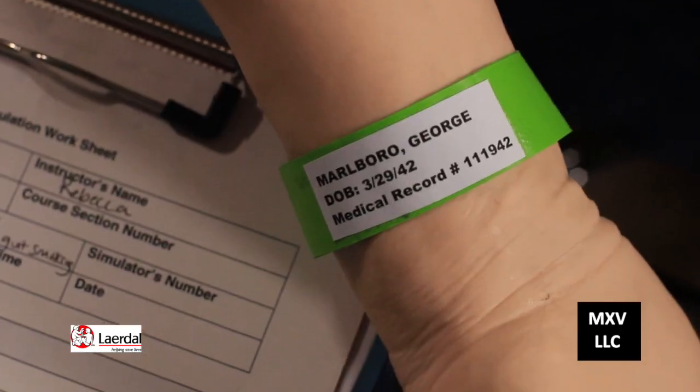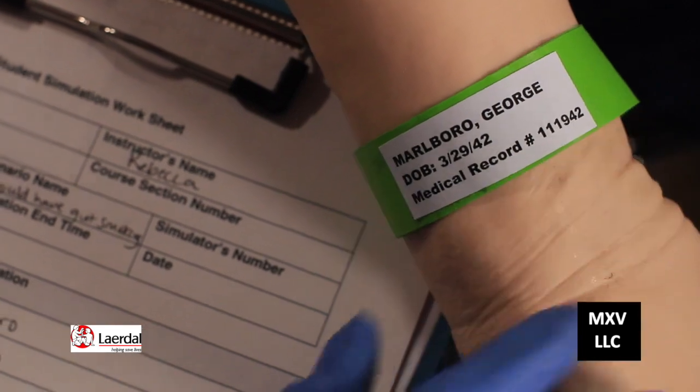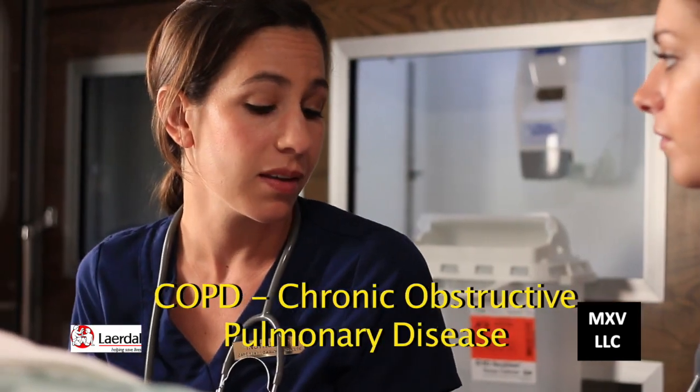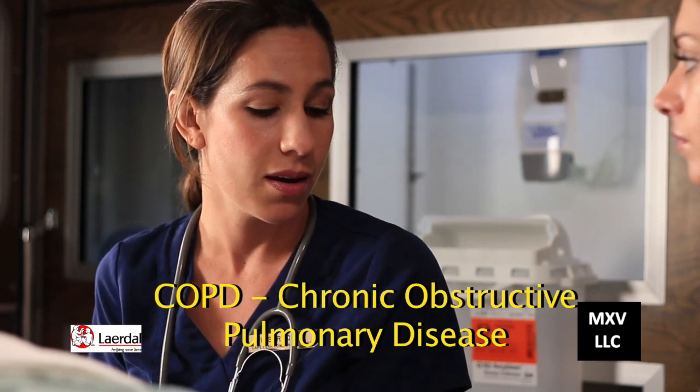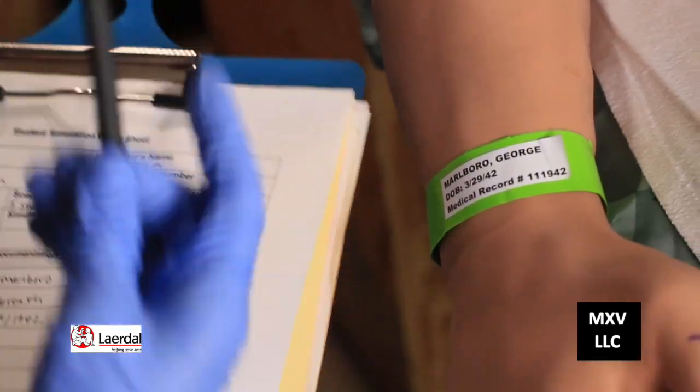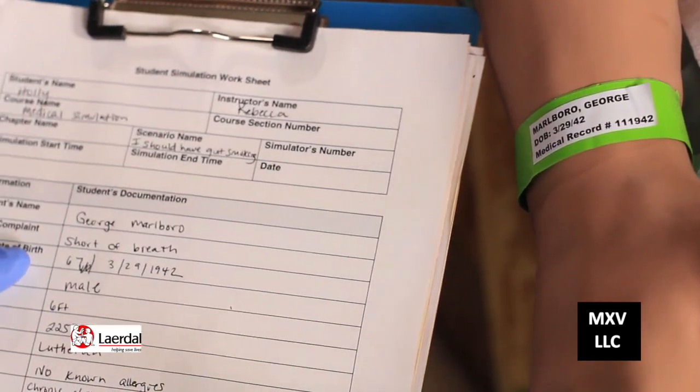This is where we need to confirm the patient's identity. We've got George Marlboro. He's 67 years old, and his chief complaint is that he's short of breath. He has COPD. Go ahead and confirm the patient's identity. Birthdays match with the armband and my medical records. Go ahead and introduce yourself to the patient and explain to him that you're going to be drawing blood.